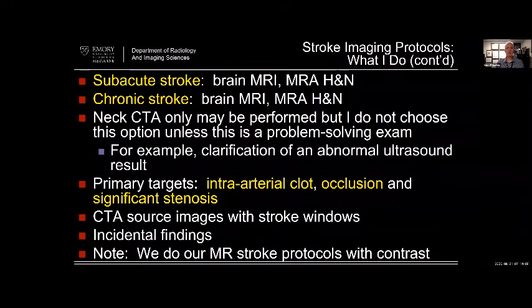For subacute stroke, you'll see it's kind of the TIA workup. For chronic strokes, it's also kind of the TIA workup in terms of how I do it.